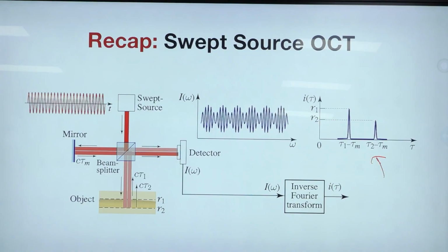In most of yesterday's lecture, I talked about a lot of different ways in which you can use OCT for biomedical and clinical applications. Yesterday I gave you an example of this endoscopic probe where it looks to the side. It's a pill which you swallow, for example. It does a circular scan of the entire cross section of the esophagus, and as it goes along, you can get cross sectional images from the mouth to the stomach, in the esophagus, the food pipe.